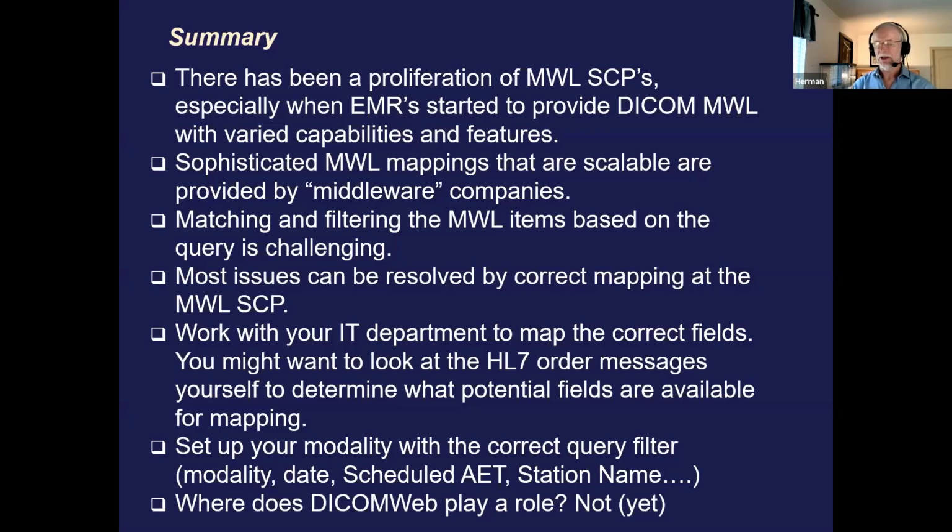If you think about a web-based implementation, you really want to use that on a web-based device, for example, your phone or your tablet. That's where you can very easily deploy these web-based interfaces. A CT scanner is not necessarily connected to the web, and does not really have a web-based interface.